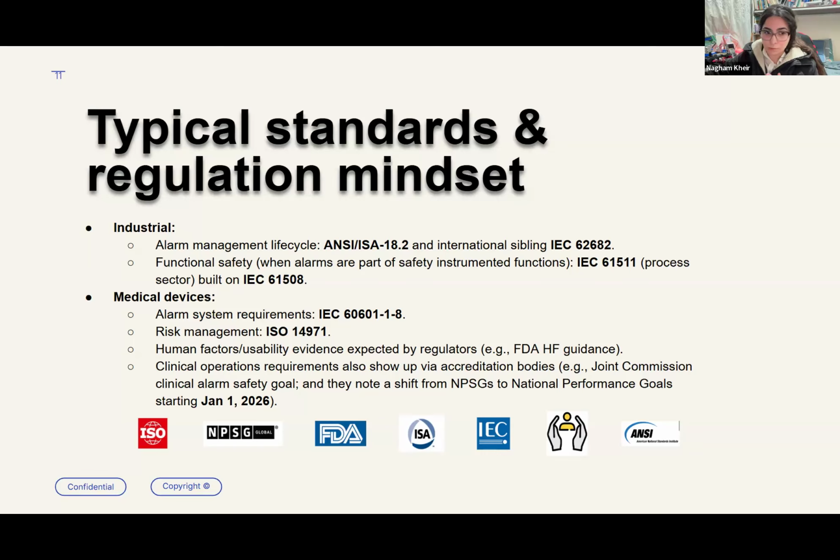We do not assist colored light in our Krake, right? Maybe this might be in a future design. I'm not saying we're planning for it, but I'm just giving an example of how right now we're not compatible with these standards. But why are we talking about these standards?